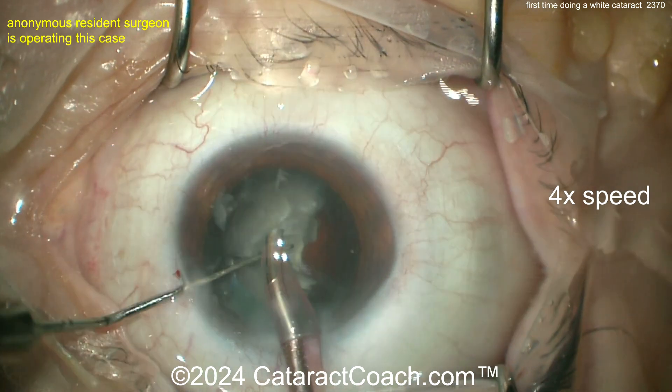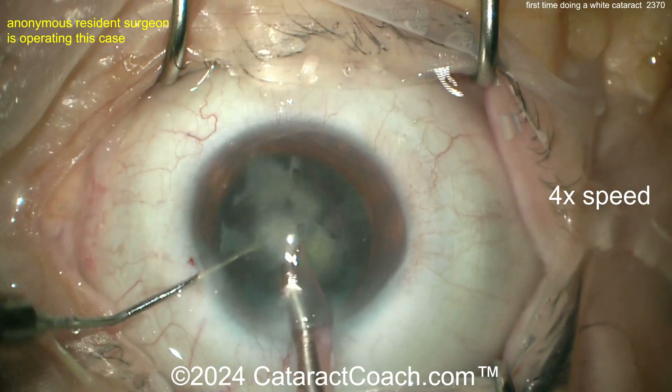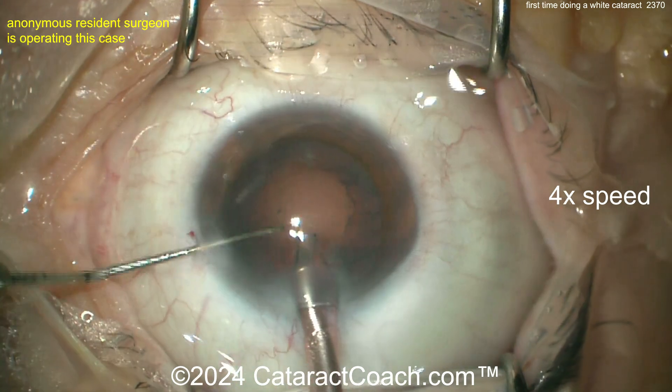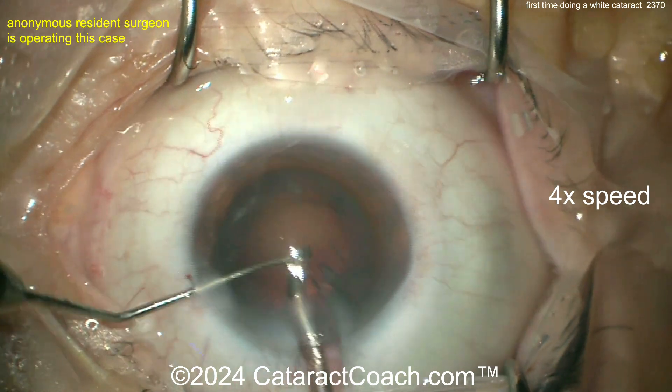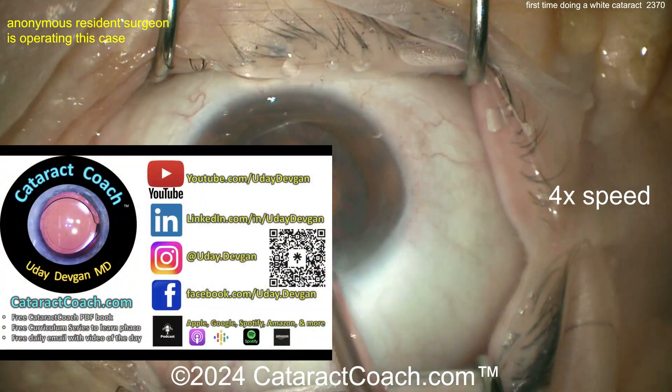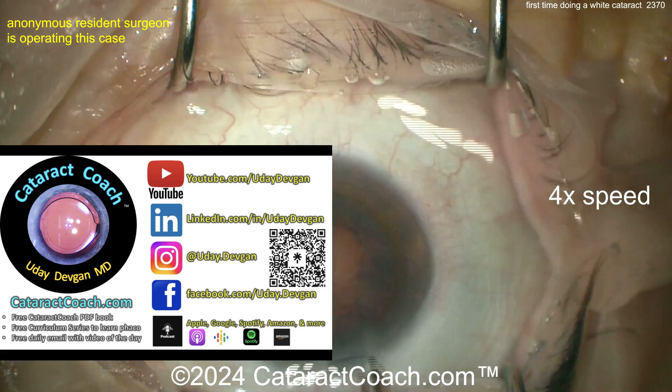We've sped the video up to four times normal speed. In reality this surgery took a little more than 20–25 minutes, which is very reasonable for a resident case. Cleaning up beautifully.